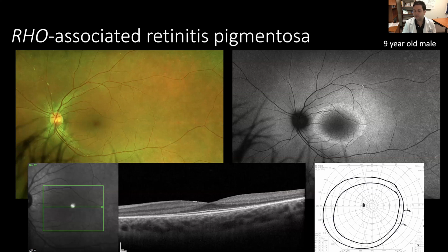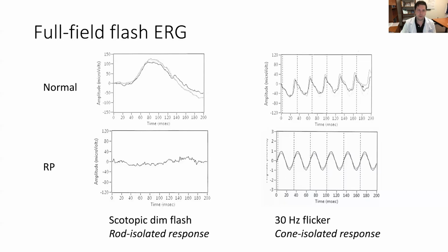Right now, the patient has normal visual fields. I give an example of a Goldmann visual field showing that it's normal. This can be some of the earliest picture of retinitis pigmentosa. You do not need to have the pigment that you might classically see in those photographs in your textbooks of retinitis pigmentosa. But structurally, we can already identify changes in thinning of the peripheral photoreceptors. And an ERG really tells the tale.